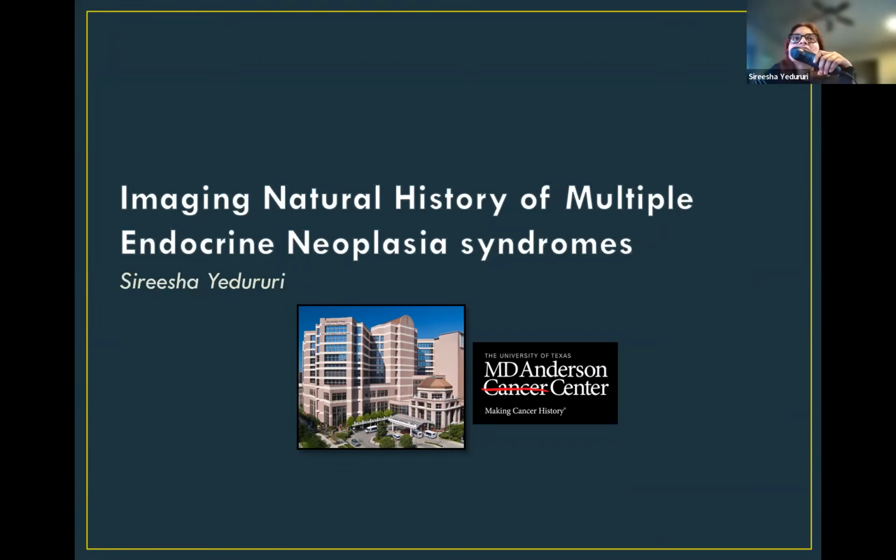So today I'm going to talk about imaging natural history of multiple endocrine neoplasia syndromes. And I have to tell you something before I start. When I started reviewing all these cases during my routine image interpretation, my interest in MEN syndromes grew.